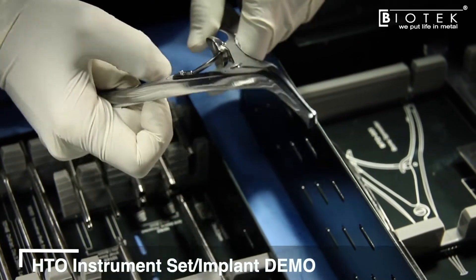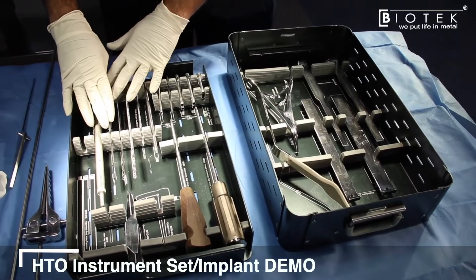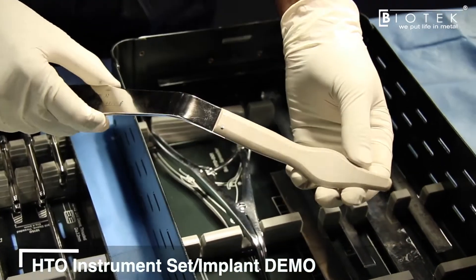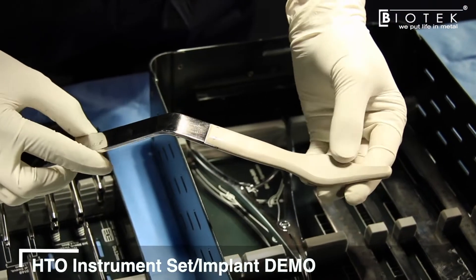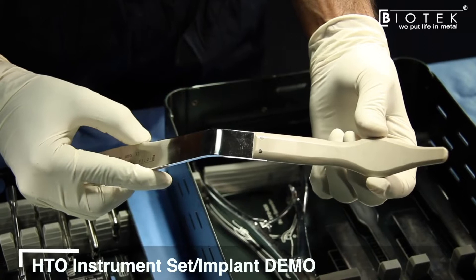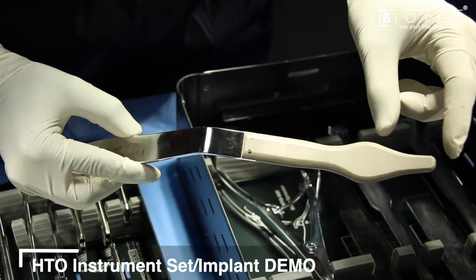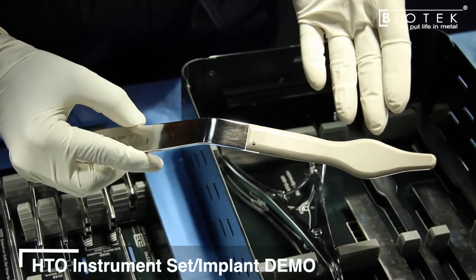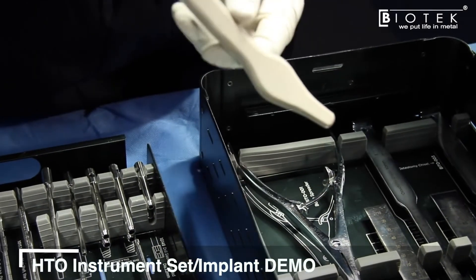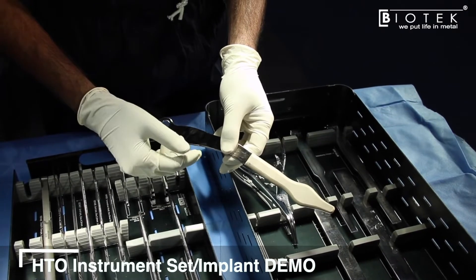To release the bone spreader, simply push the release and it comes out easily. A specially designed radiolucent retractor is then placed on the posterior surface of the tibia to protect the popliteal neurovascular bundles. Its profile allows easy entry, and its dimensions are adjusted so that once the tip is near the lateral cortex, it protects the vital posterior structures. Since it is radiolucent, it does not interfere with fluoroscopy.